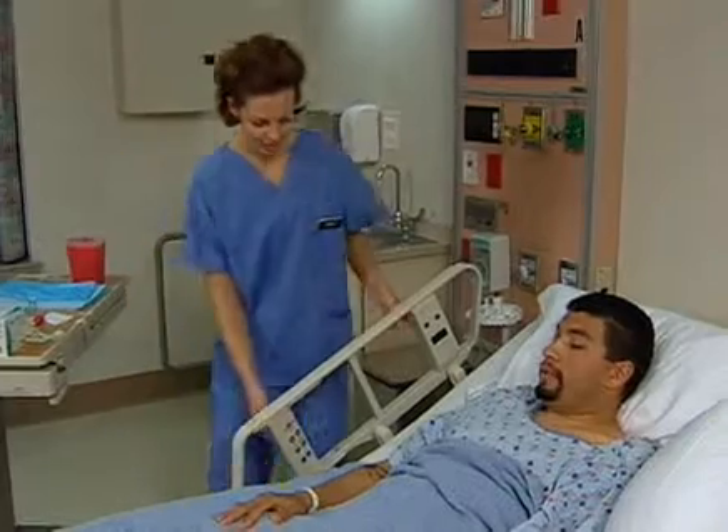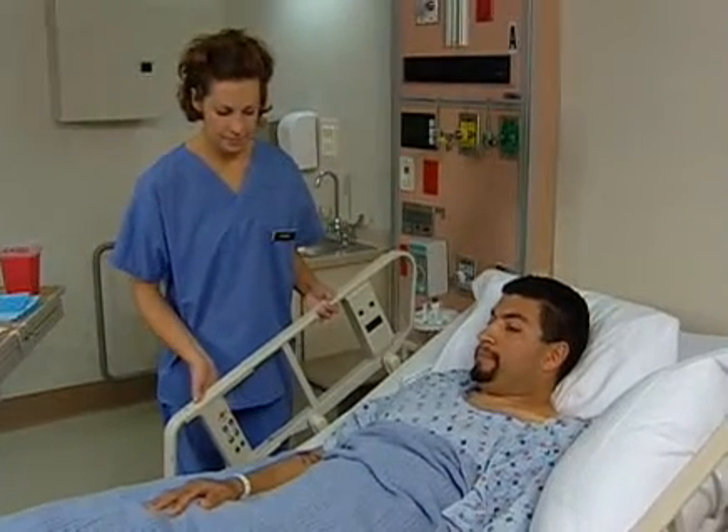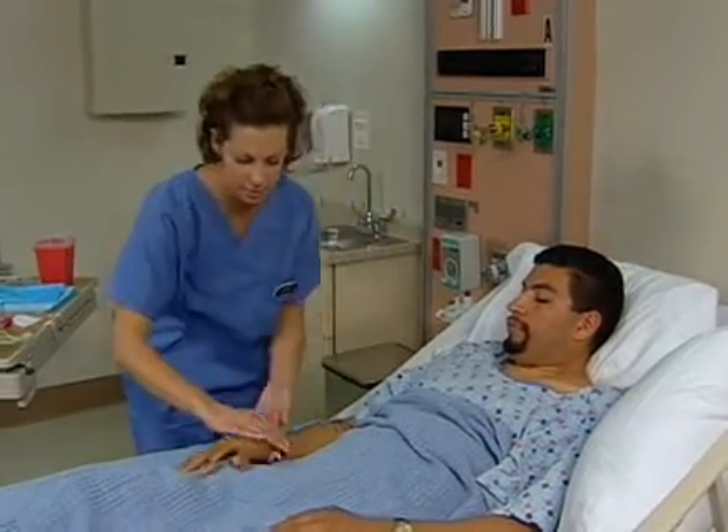Hi, Lupe. My name is Krista. I'm your nurse. I'm going to draw your blood, okay? I'm going to check your wristband.